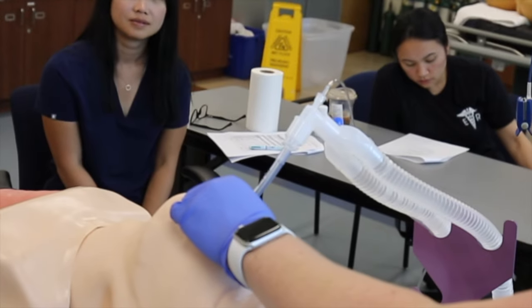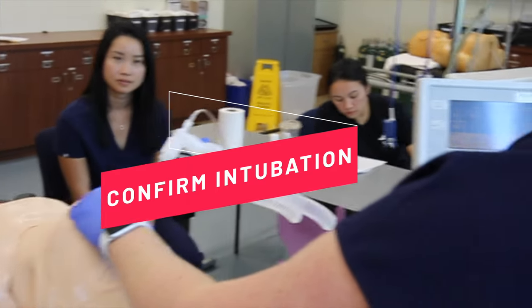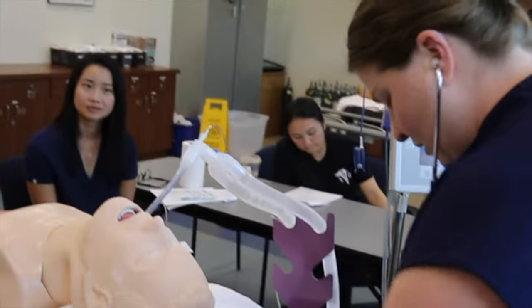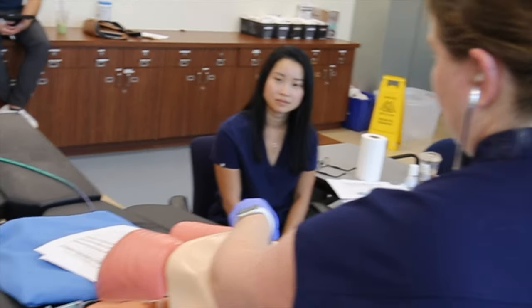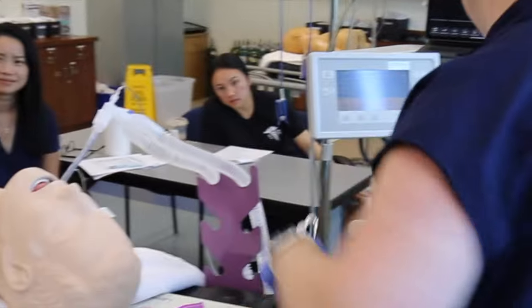And I am confirming placement. I'm watching for fog in the tube, I'm watching for chest rise, and I'm watching for end-tidal CO2. I'm also going to grab a stethoscope, which you would obviously already have around your neck. And you're going to listen left, right. And then for extra good measure, we're going to listen for negative epigastric.